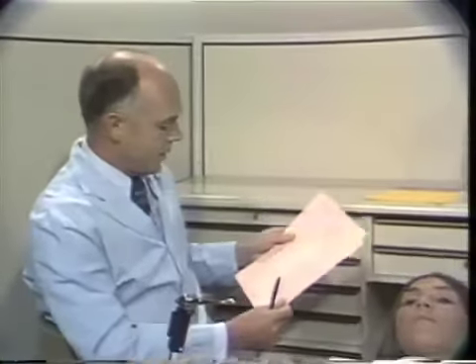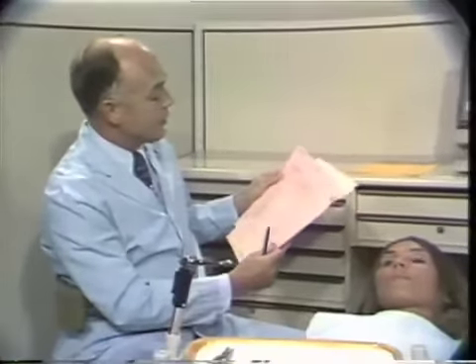Today we're going to do an examination of the teeth. For purposes of this demonstration, we will assume that the following records have been filled out and completed. Health questionnaire, form number 3A. The history of the patient, number 3B, and the clinical examination, that is the head and neck examination and soft tissue examination of the head and neck and in the oral cavity.